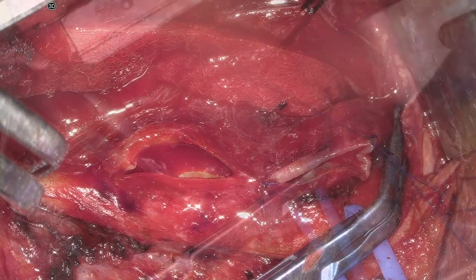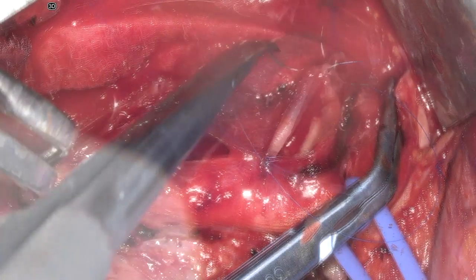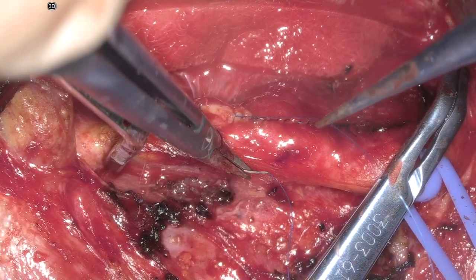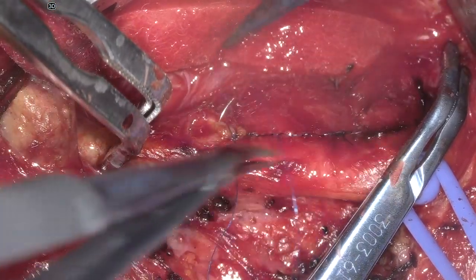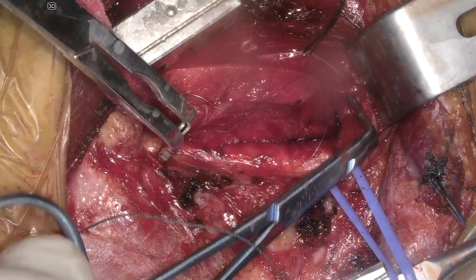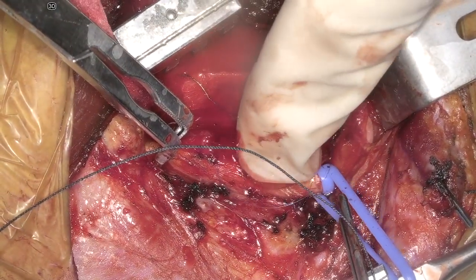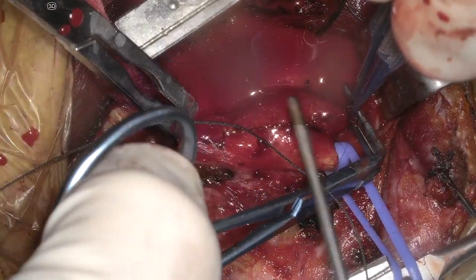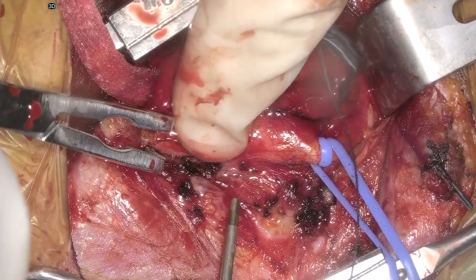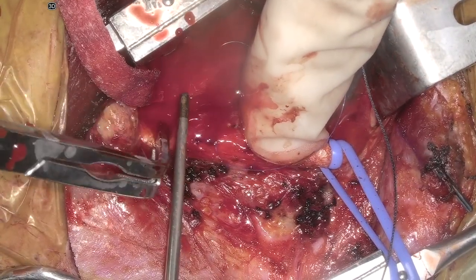We use copious heparinized saline throughout to prevent clot formation. As we get closer to the common, we backbleed the different segments: first we backbleed the internal, seeing blood come through the small opening, then reclamp the internal followed by forward bleeding the common for a few seconds. Then we re-heparinize the lumen with heparinized saline and finish the arteriotomy with 6-0 prolene.